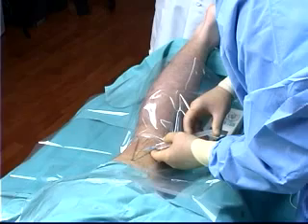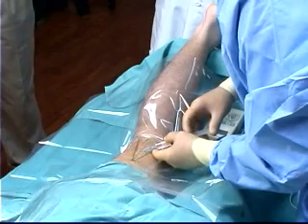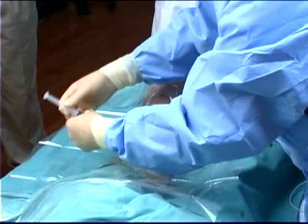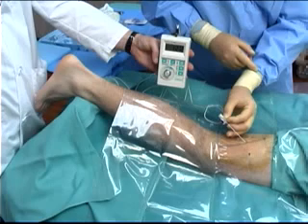The skin and subcutaneous tissue, as well as the intended path of tunneling of the catheter, are anesthetized with a fine needle and lidocaine with epinephrine 1 in 200,000 solution. A 17 or 18 gauge insulated Tuohy needle is attached to a nerve stimulator set to an output current of 1.0 to 1.5 milliamps, a frequency of 2 Hz, and a pulse width of 100 to 300 microseconds.